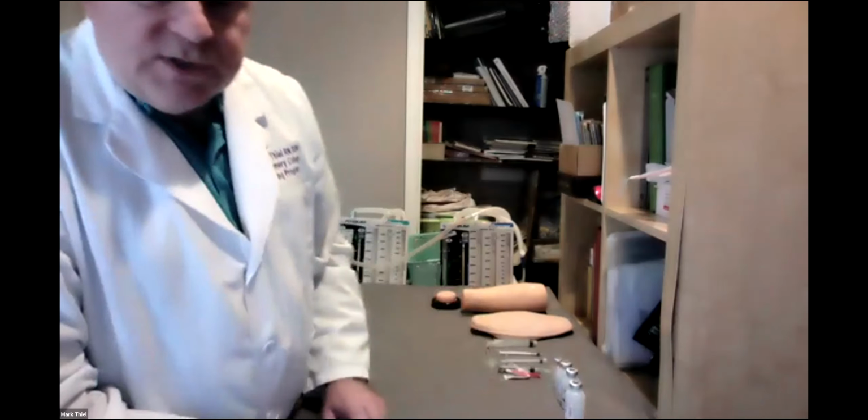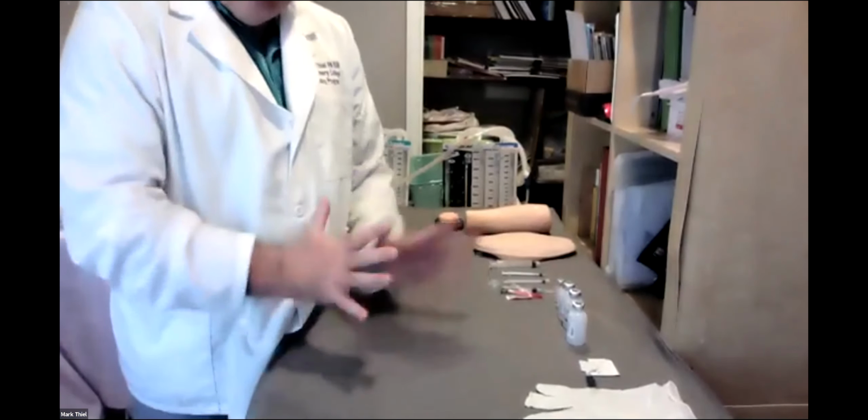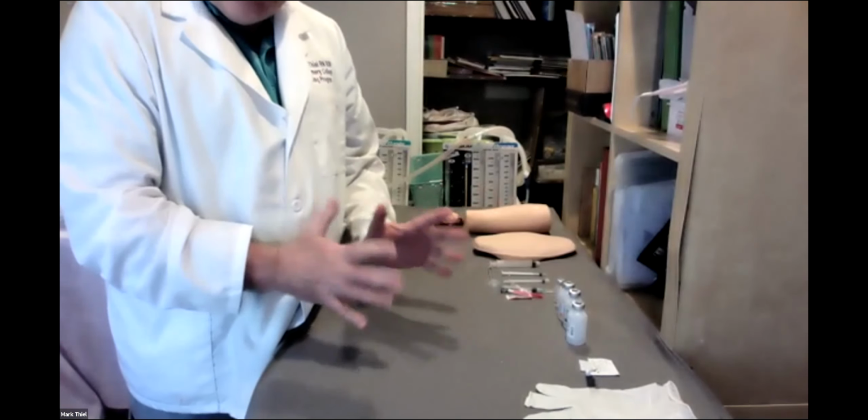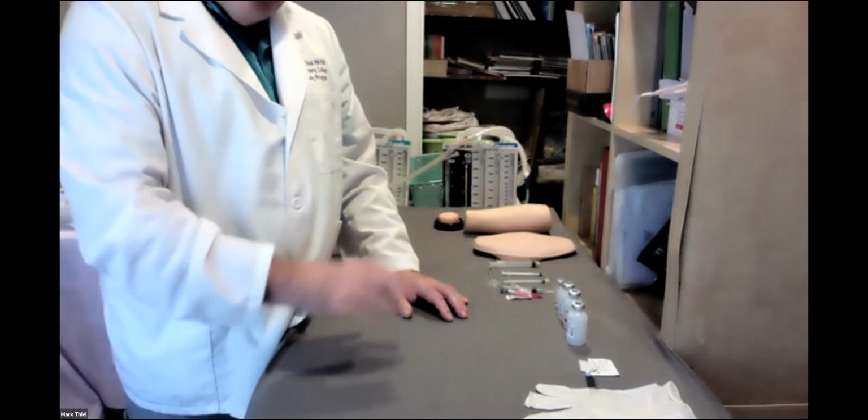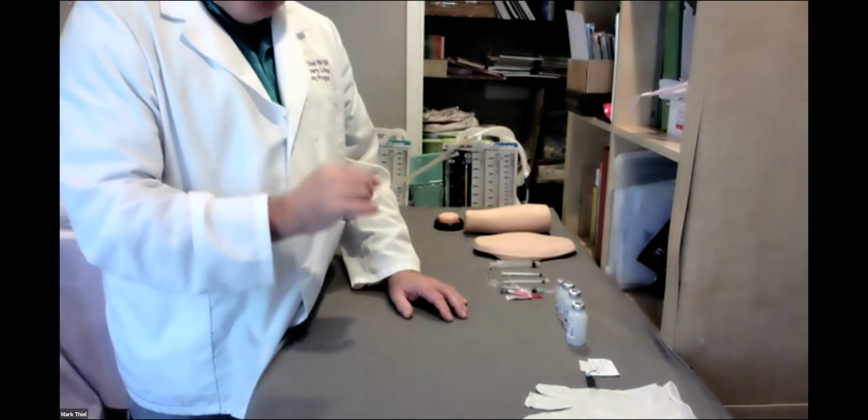Notice I'm in the med room right now. I'm going to be prepping the medication. I'm barehanded. When do we put our gloves on? When we go to give the injection and we're touching the patient.